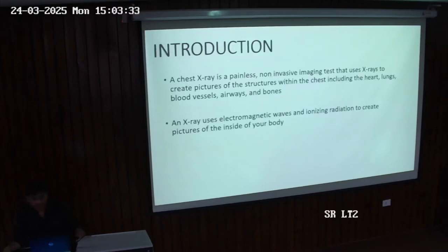Chest X-ray is a painless, non-invasive imaging test that uses X-rays to create pictures of the structures within the chest, including heart, lungs, blood vessels, airways, and bones. Whenever in cardiology we need to see the structure of the heart or lungs, especially the lungs, we prescribe a chest X-ray, and it indirectly indicates an impression of the heart, if there is a cardiomegaly, and other structures we can identify. X-ray uses electromagnetic waves and ionizing radiation to create pictures.